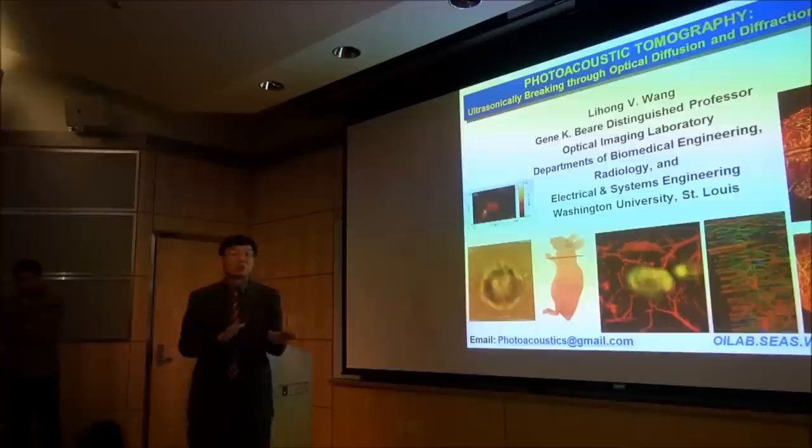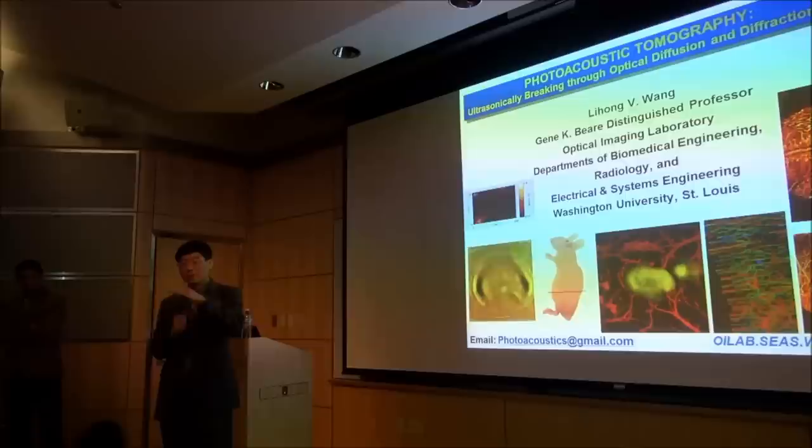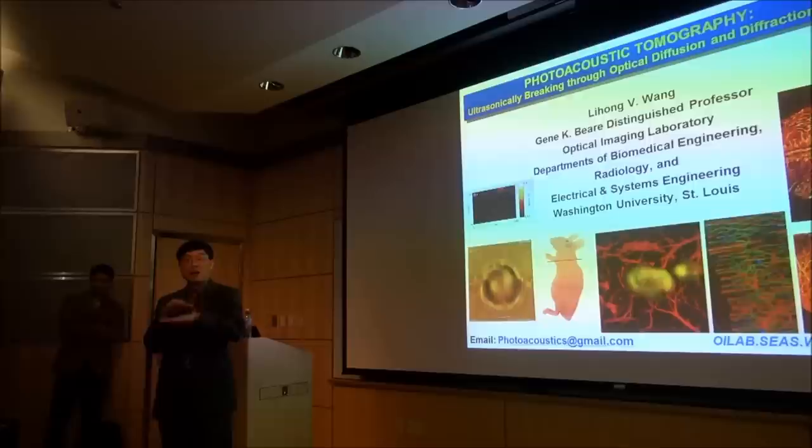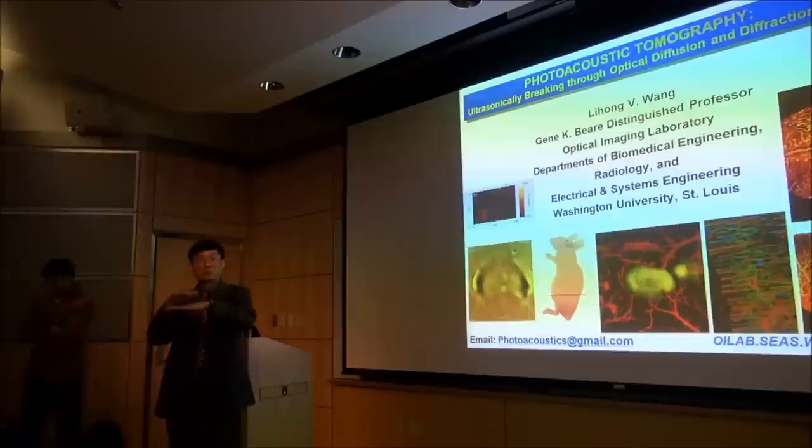With the optical part, you follow the ANSI safety limit. And again, that's extremely conservative, right? The damage threshold depends on the color of the skin. Usually in the visible spectrum range, the darker the skin, the higher the melanin concentration, the lower the damage threshold. But ANSI, because it's a safety standard, takes roughly the lowest damage threshold divided by an order of magnitude. They define that as the safety standard, usually at the worst wavelength.